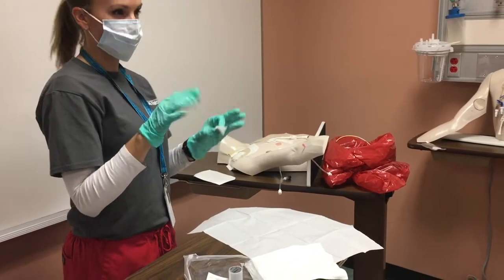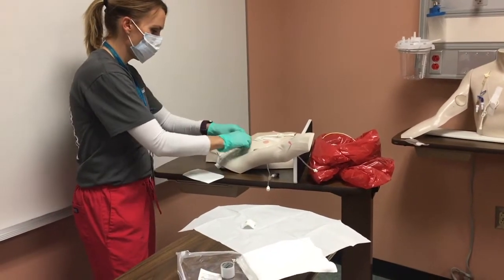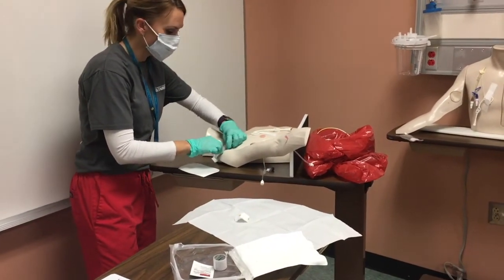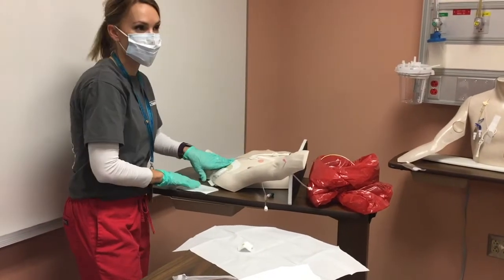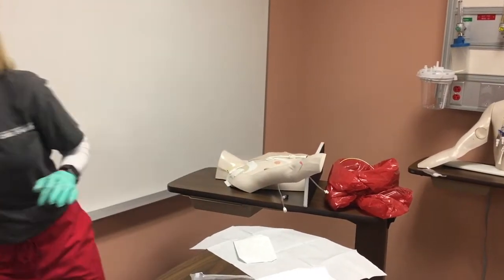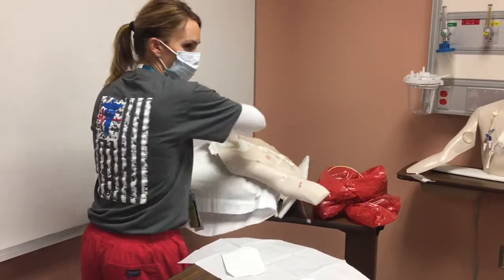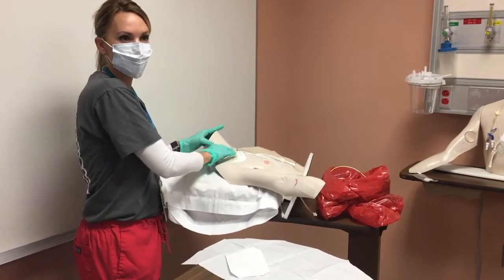Make sure it's written down to do the 4x4 then the 2x2. You would put the 2x2 on, then depending on your patient — if they're not tolerating laying flat — once you have the dressing on and secure you can go ahead and sit them back up. You can also take off your mask once the site is covered.